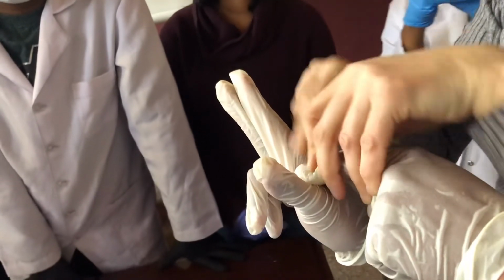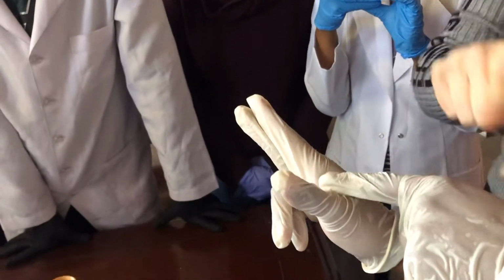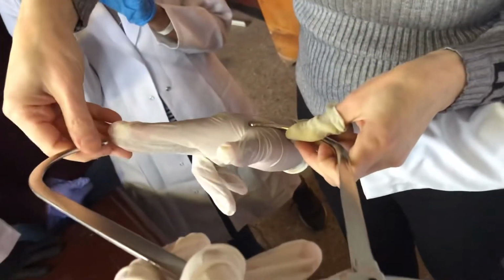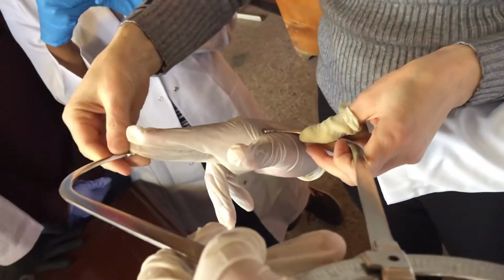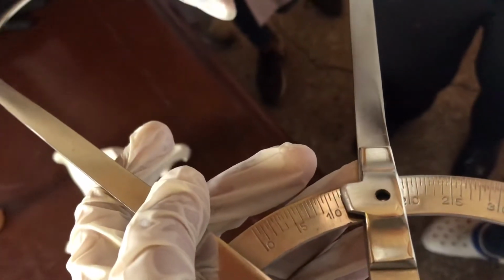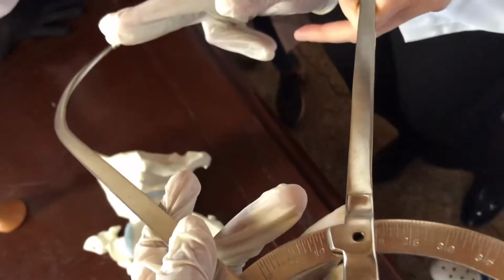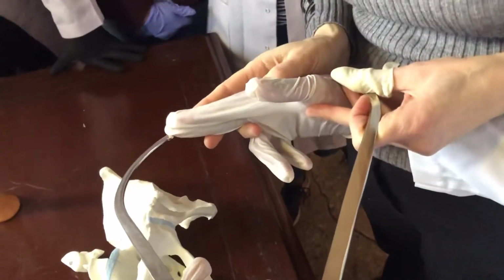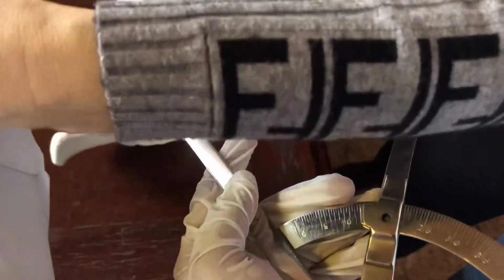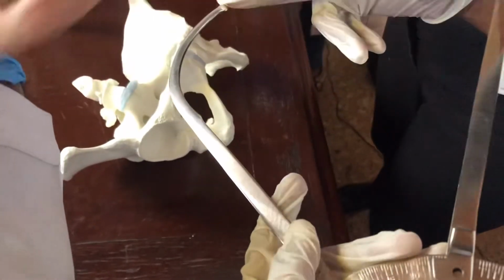Remember this point and take the pelvimeter by your left hand. From this point to middle finger, not index. This is the length of the diagonal conjugate. Normally measures, guys, 12.5 to 13 centimeters.